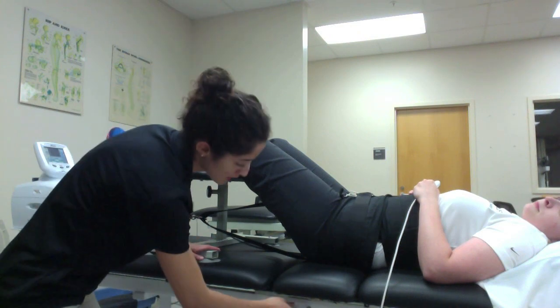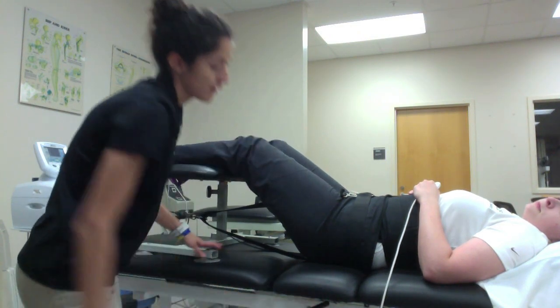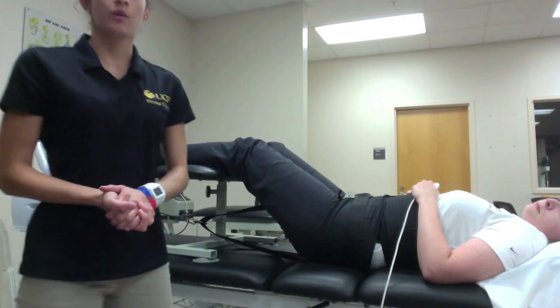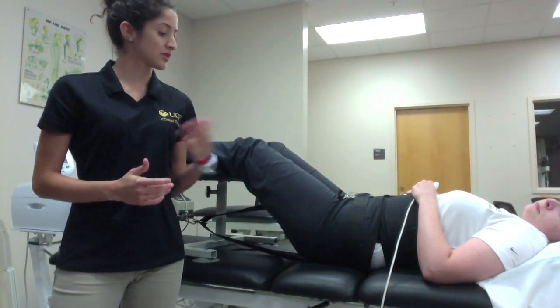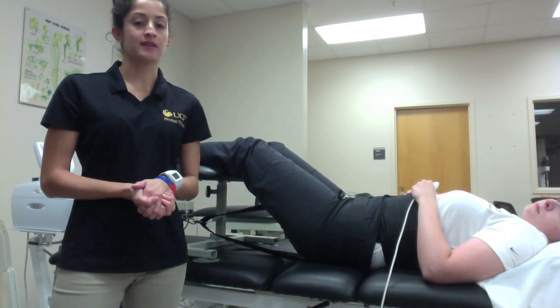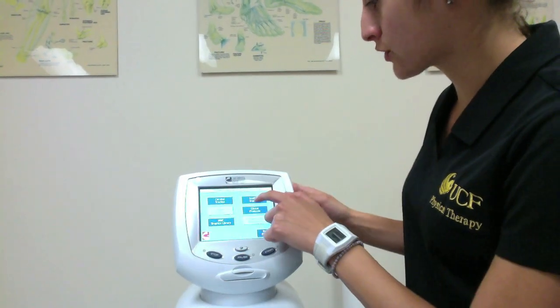And I want to make sure I unlock the table in order for the distraction force to actually be applied through. Also, once the treatment is over, I want to make sure that the table is locked and that the patient gets up slowly as they may be dizzy from the treatment from being laid down for a period of time. So we're going to set it for lumbar traction.